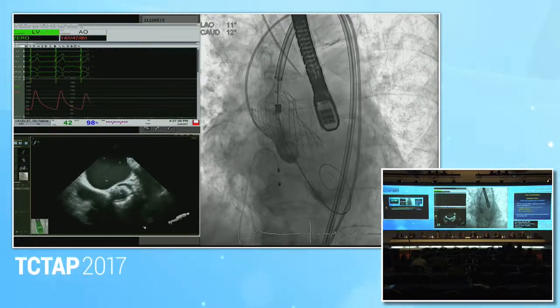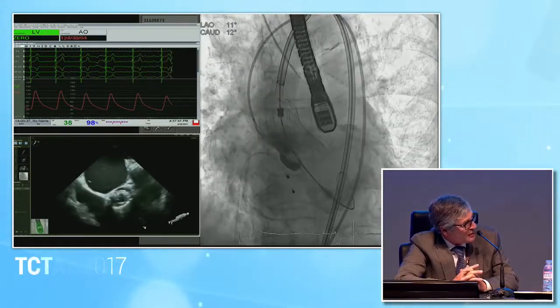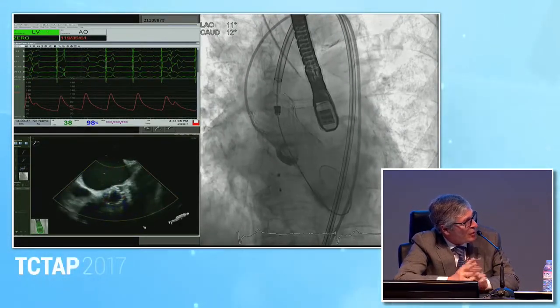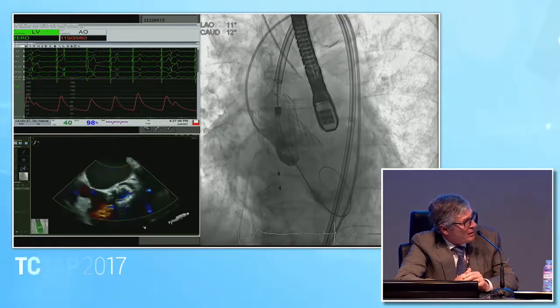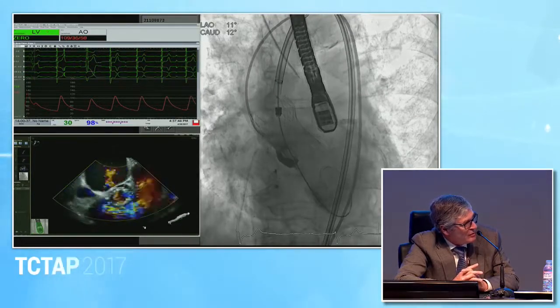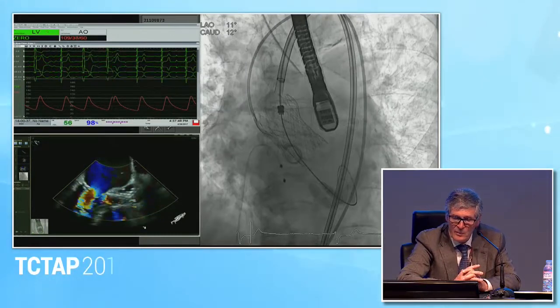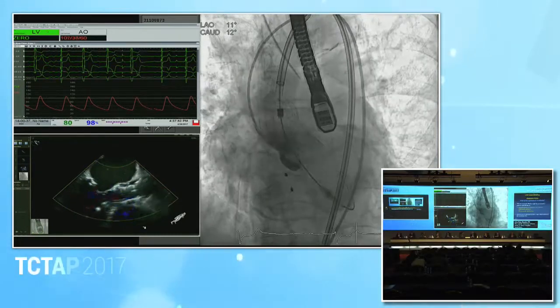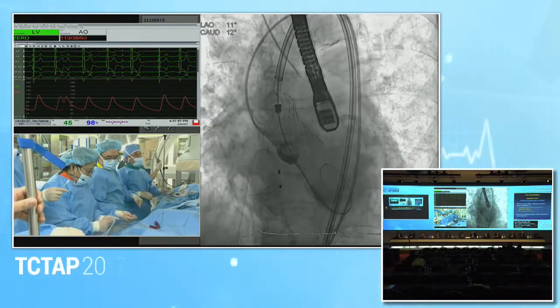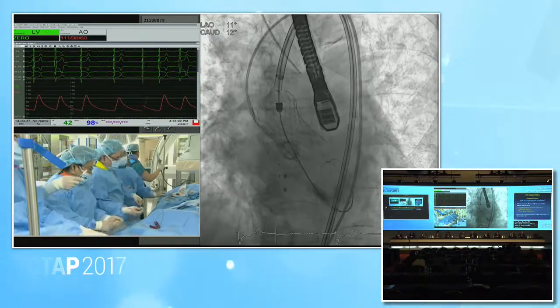I think if you have a good echocardiography after deployment of the valve, including transthoracic echo, you can really assess, in the majority of cases, aortic regurgitation, more than grade 1 or not. Sometimes you should use hemodynamics, but in the majority of cases, good echo is enough. We generally use hemodynamics heavily because it's cheap and it's very quick. Just putting a pigtail catheter in and taking the wire out also improves the transvalvular appearance. So, the different practices.